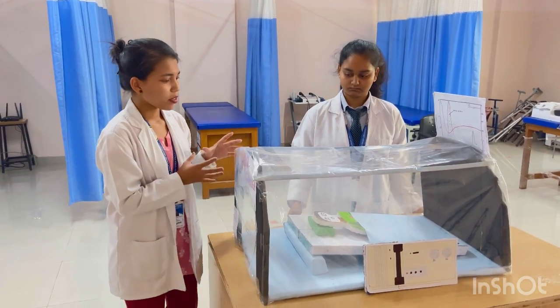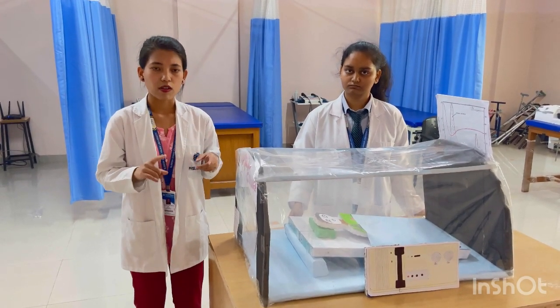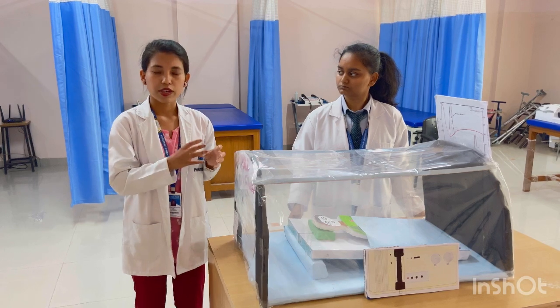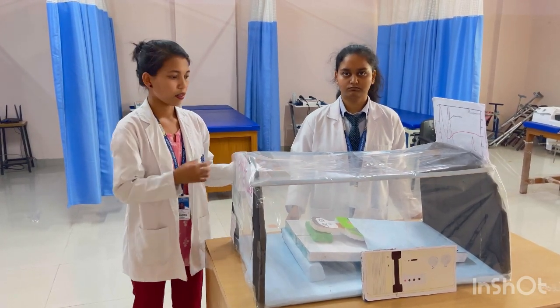And we use this therapy for CP patients, when the baby is being born. Due to the lack of oxygen, they suffer from cerebral palsy, which means it affects one part of the brain, and oxygen and blood circulation are not able to reach it. For that, we keep the baby inside this chamber.